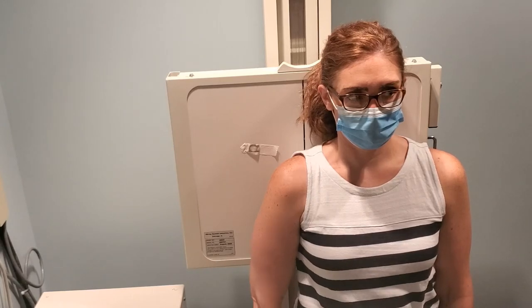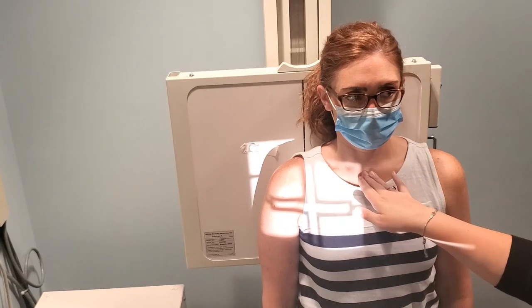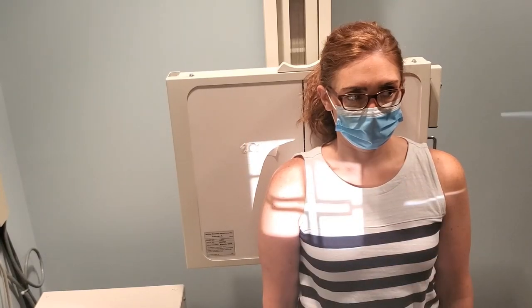Those are the first three — the easy ones you're going to want to pull. Again, just below the coracoid for your centering. You want to get from the vertebral end of the clavicle all the way through the end of the shoulder. True AP position — make sure they're not slouching or rotated. That's the easy one of this section.